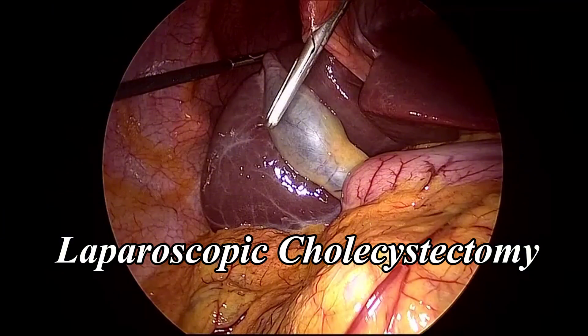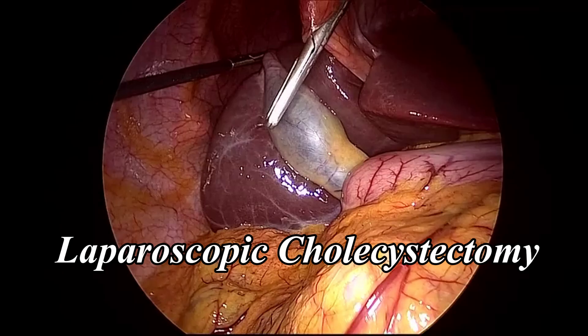The patient is placed in reverse Trendelenburg with left-side tilt to move the small bowel away from the gallbladder.